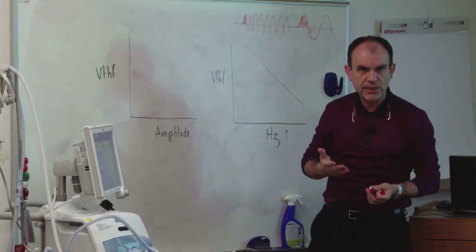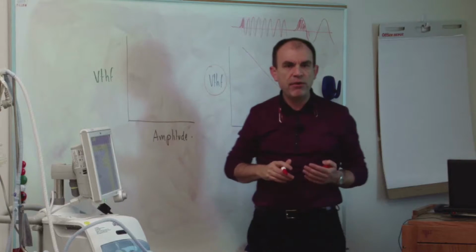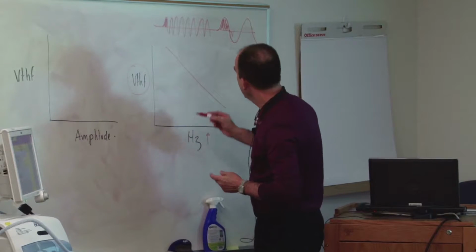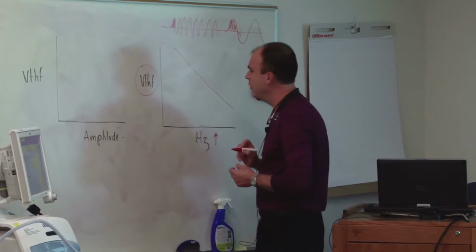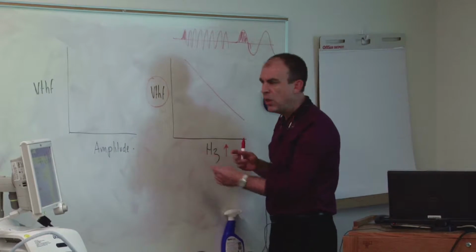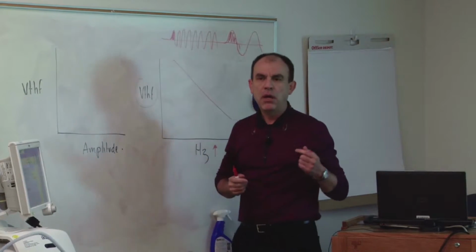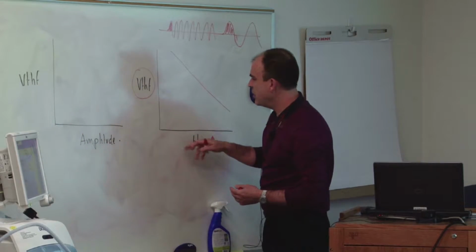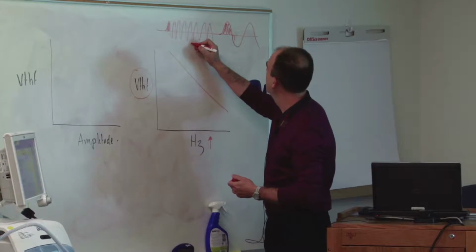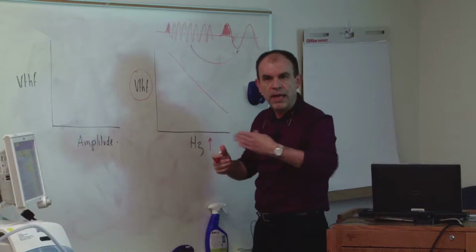in volume, basically. And since this parameter relates very efficiently and very well with CO2, the more you increase the frequency, the lower you will have VTHF and vice versa. So that is why when you decrease the frequency in a high-frequency ventilator, you actually improve ventilation, because you move from this to this, where you have more volume being actually oscillated.